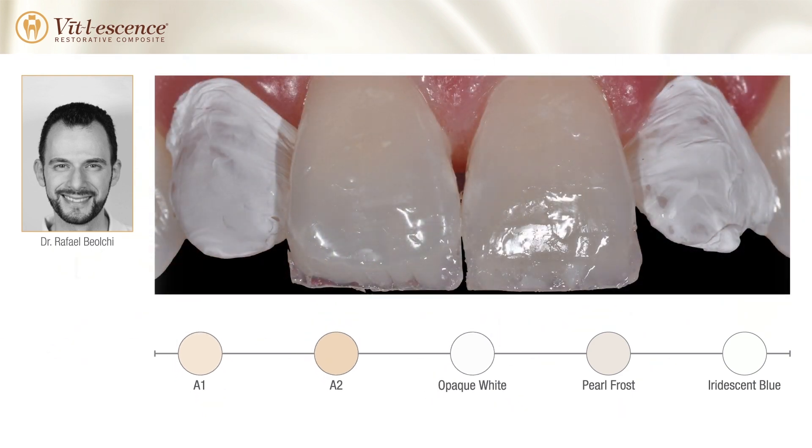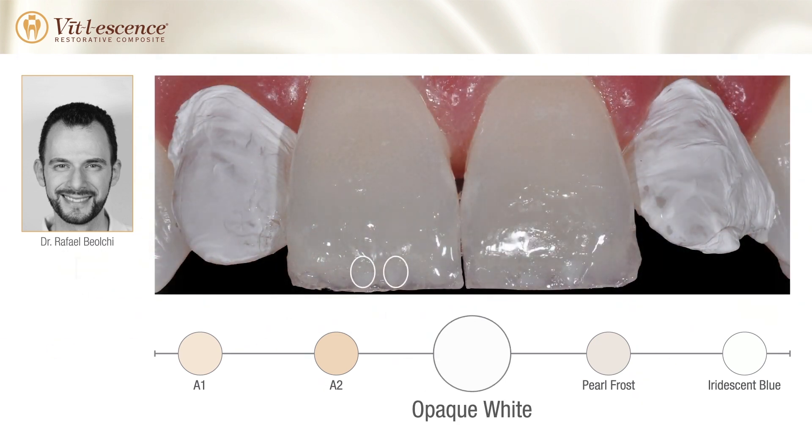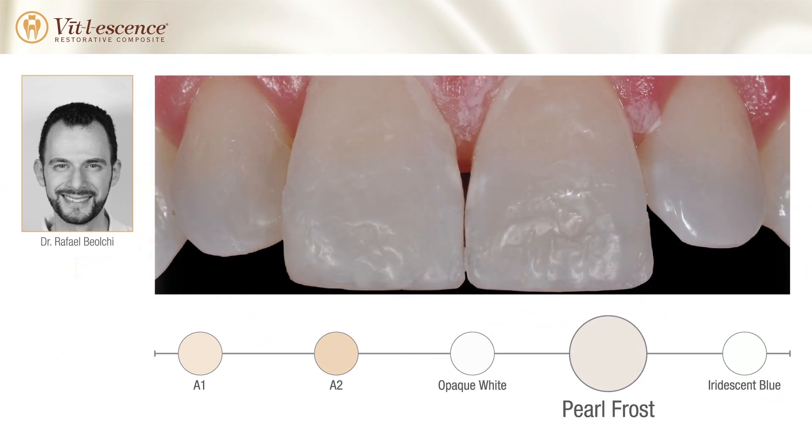After the creation of the mamelons, opaque white and iridescent blue shades were added. Iridescent blue provides a natural translucency and opalescence on the incisal edge. Pearl Frost enamel shade was then used for the final layer.